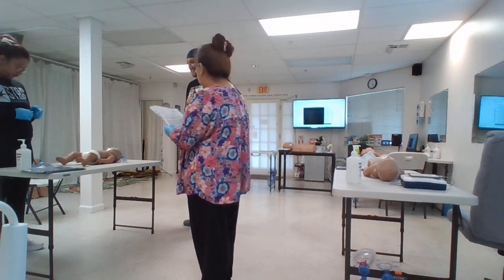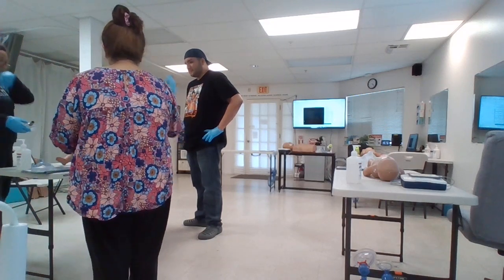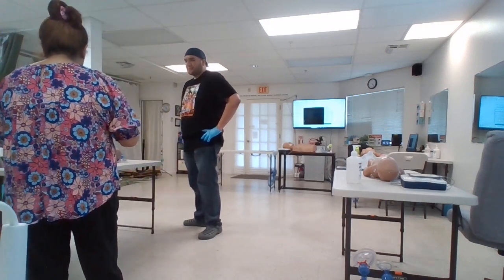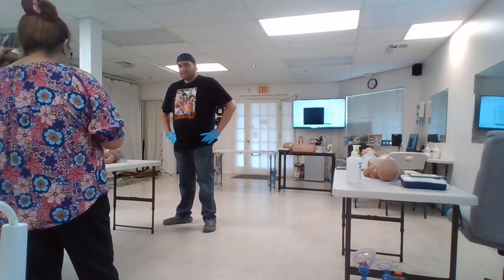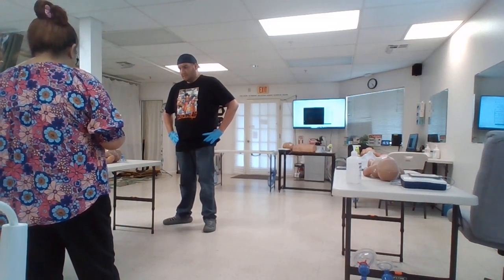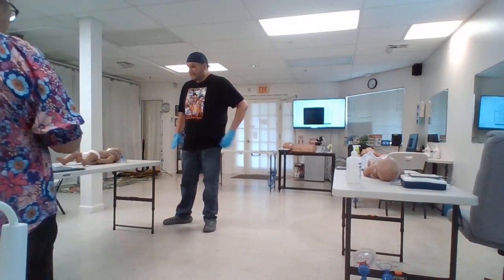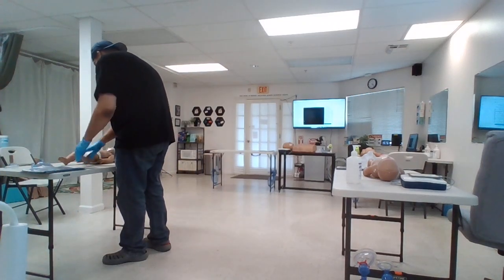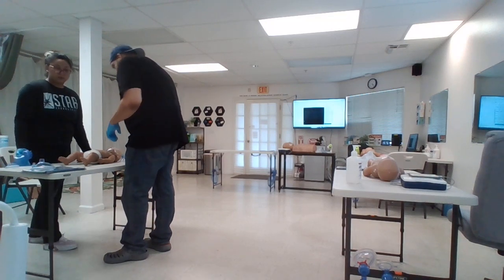Edward Lopez. So I'll evaluate first. The scenario is, you arrive at the scene and an infant is not breathing. No bystander CPR has been provided. You approach the scene and the scene is safe. Demonstrate. Scene is safe. Hey, baby. Baby. Responding. Hey, Casey, call 911. Get the AED and come back.